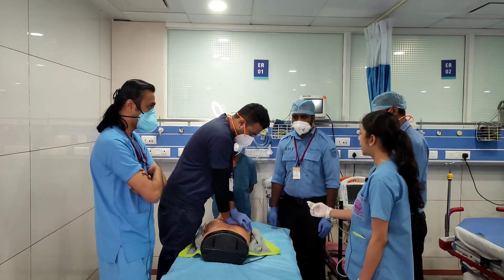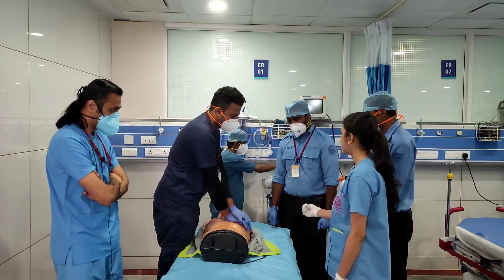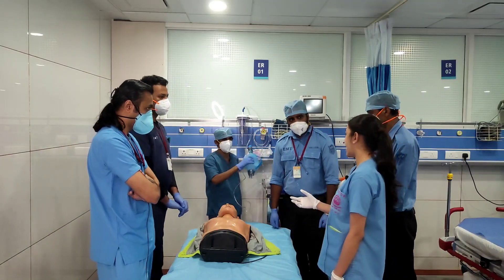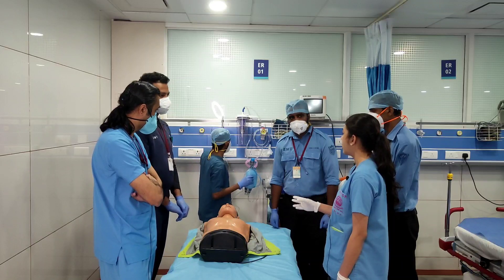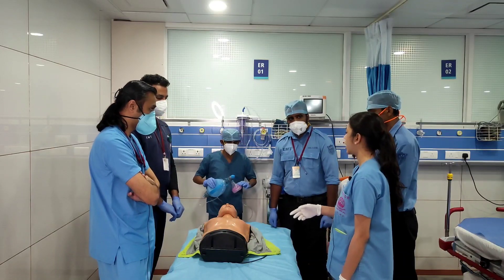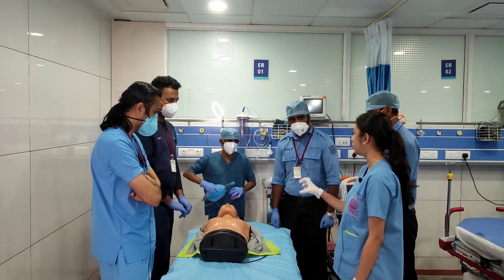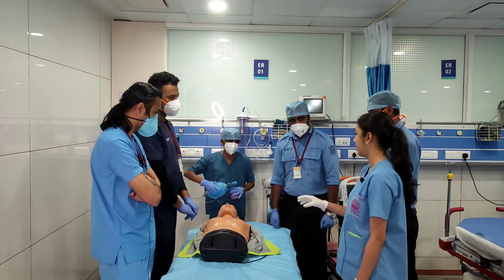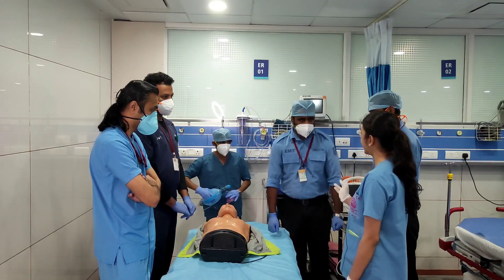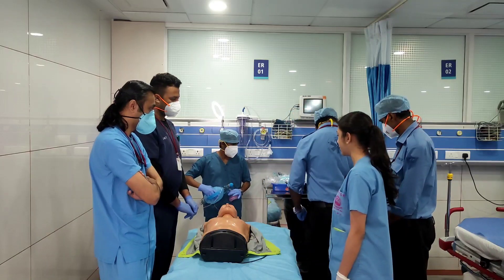Moving on to the airway — whoever is taking care of the airway should give ambo, half the bag, after 30 compressions. After 30 compressions you should give 2 breaths. Connect the cardiac monitors to the patient.